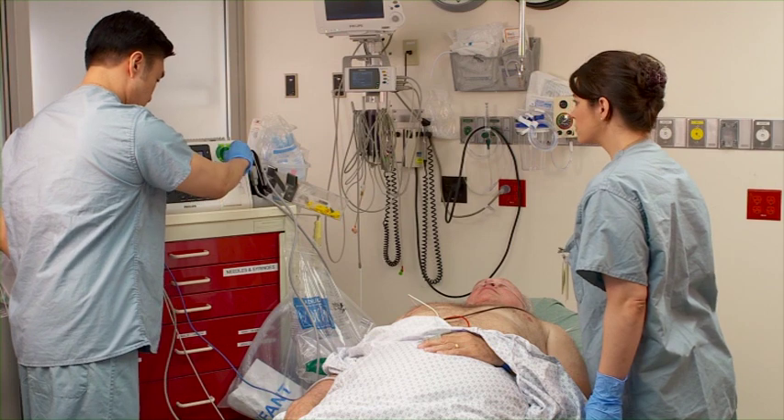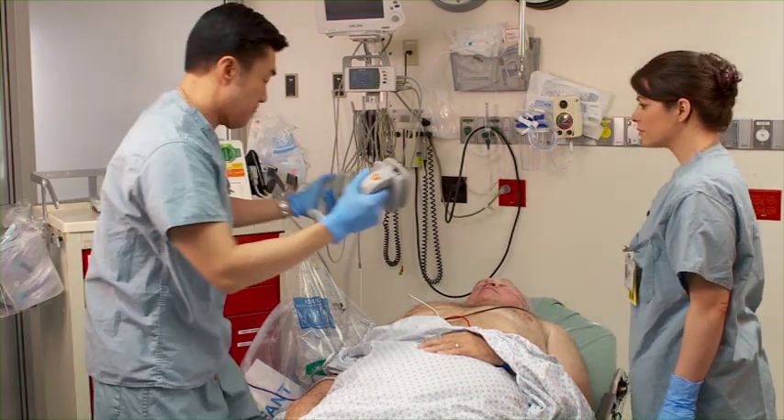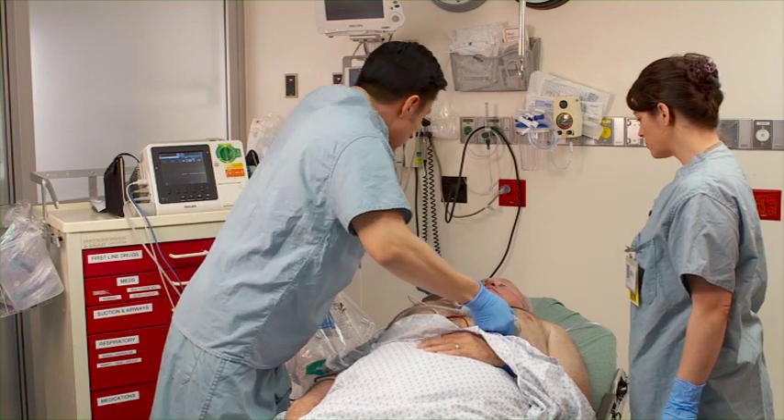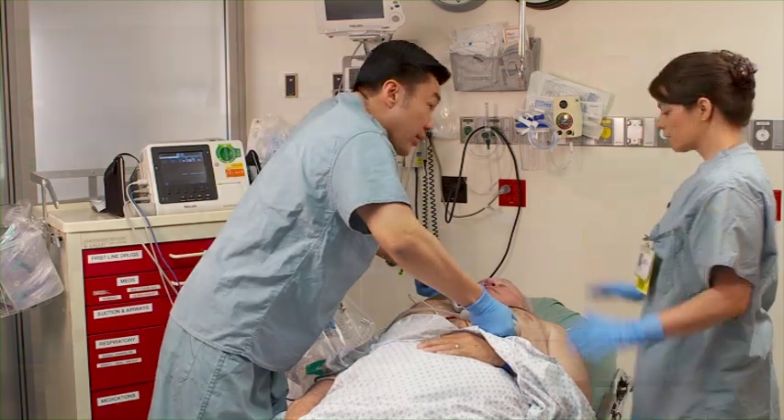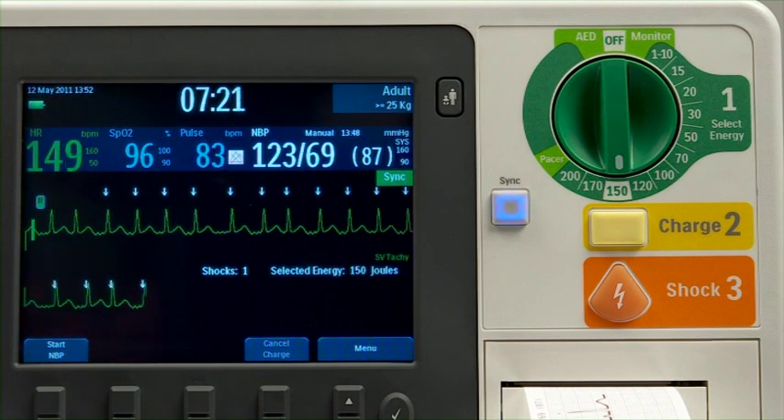Manual defib mode offers simple one-two-three defibrillation using multifunction electrode pads or external or internal paddles. Manual mode also allows you to perform synchronized cardioversion.